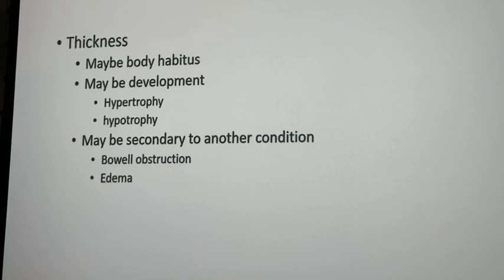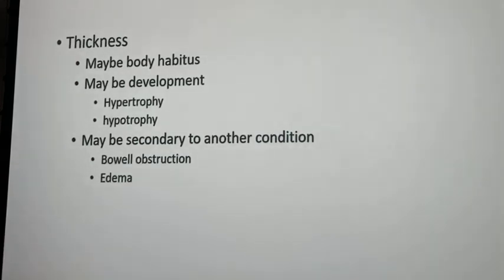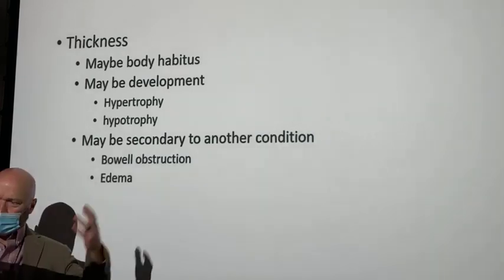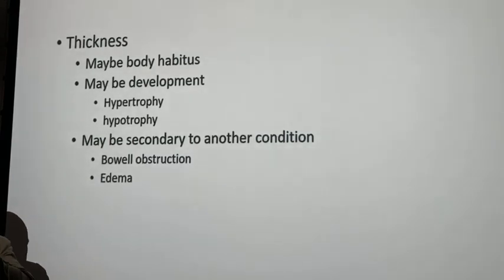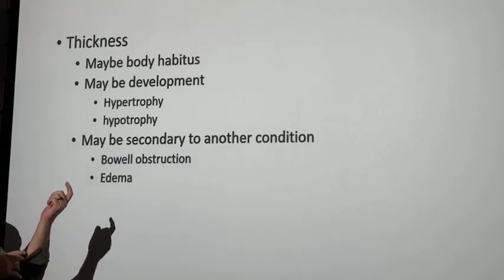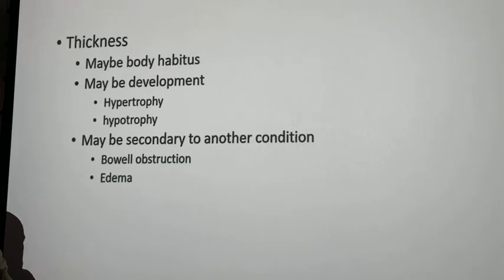Is it like the color or the temperature? Well, possibly, but your telltale indicator, you ever mash on a memory foam pillow or memory foam mattress? Does it spring right back up like an inner spring? No, you mash on it and it comes back very slowly. Now, mash on your own skin. What does it act more like? Memory foam, or does it spring back real quick?